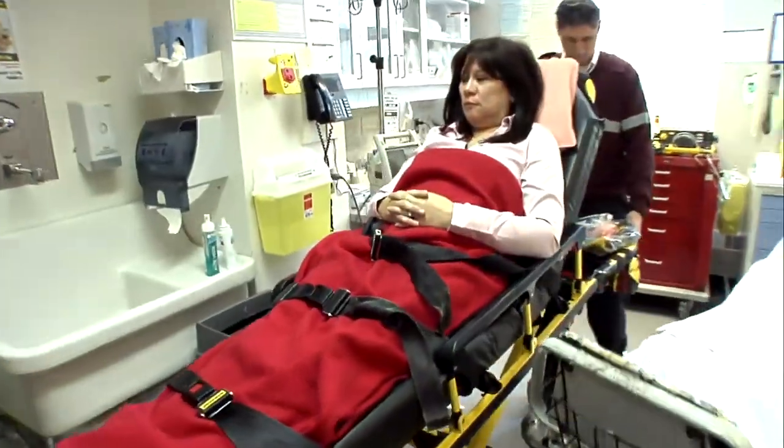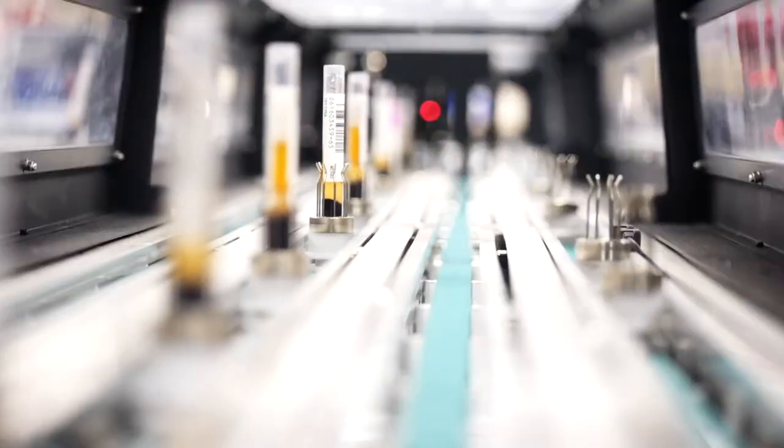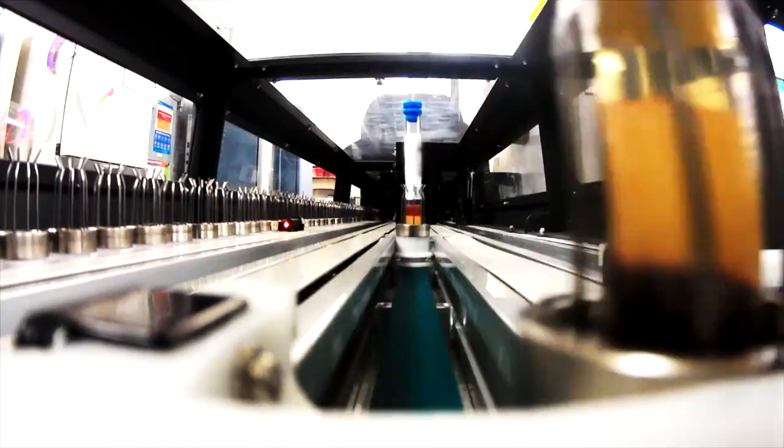In today's growing healthcare industry, laboratories must deliver rapid results at increasingly lower costs without sacrificing quality.